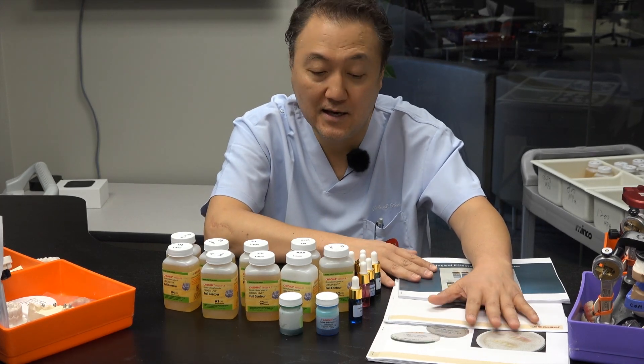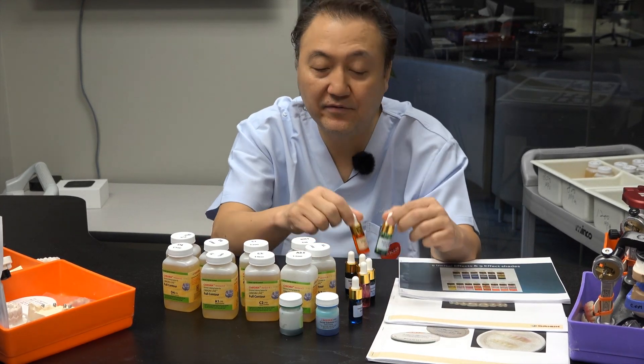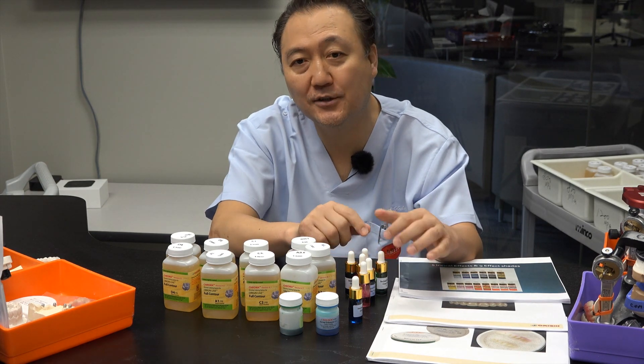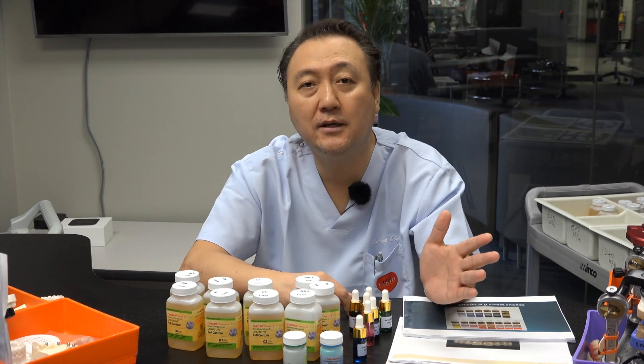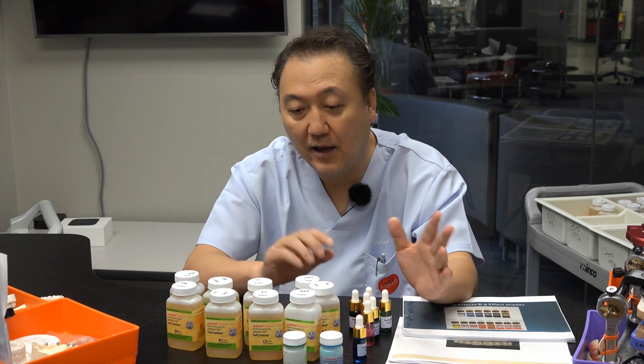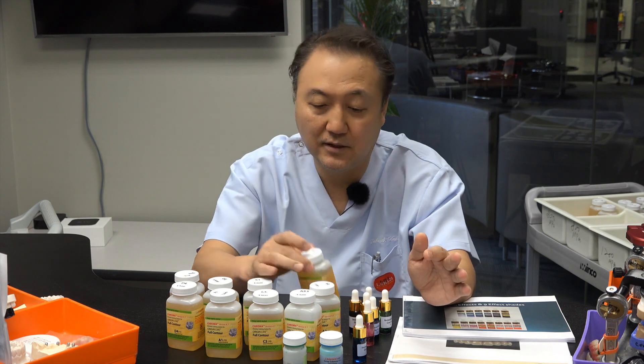You can go online and get it. They also have effect colors — incisor color, gum color — they have it all already. The FDA approved it, made in USA. Tulsa is using it. Everything is legally done, which makes me very happy.